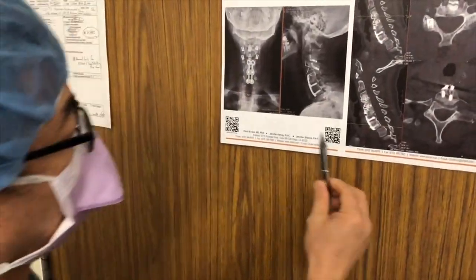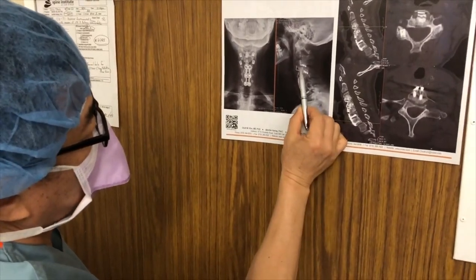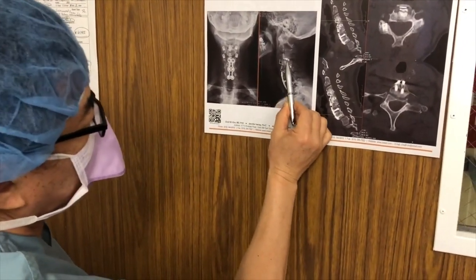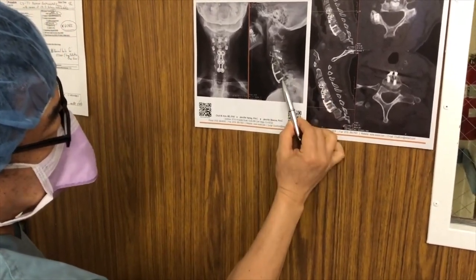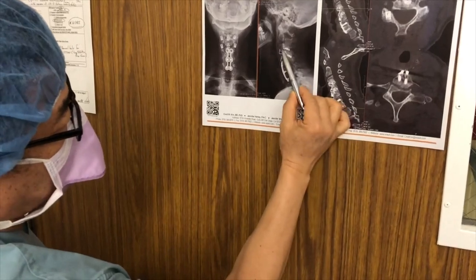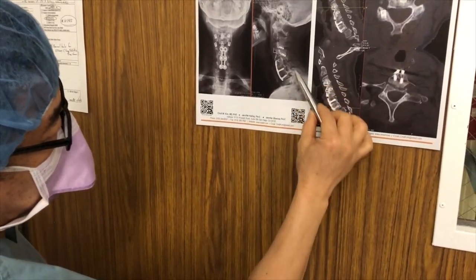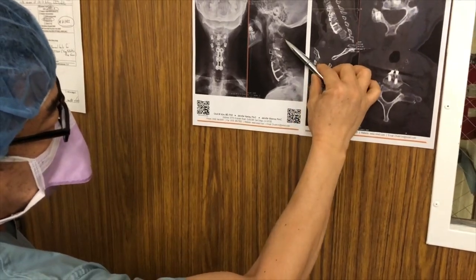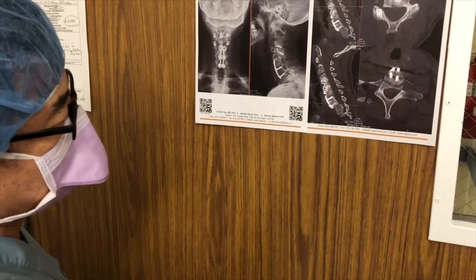Interesting case today, a patient from Arizona that's had multiple surgeries. She has a pseudarthrosis at C3-4 and an adjacent segment degeneration at the bottom of a long moment arm at C7-T1. So we'll do a pseudarthrosis repair and an extension of the fusion at C7-T1. And given the proximity of the two things, I'll just make a single midline incision and instrument all up and down so I can get a very stable construct.